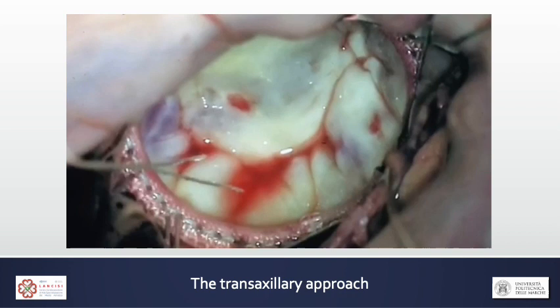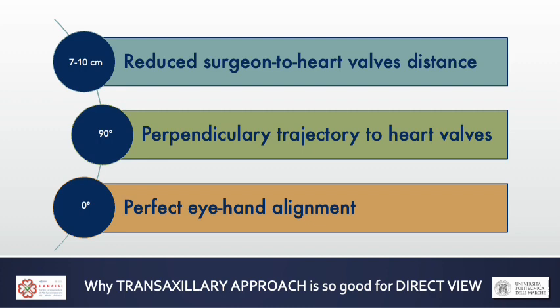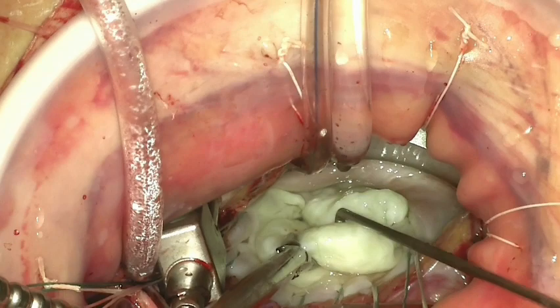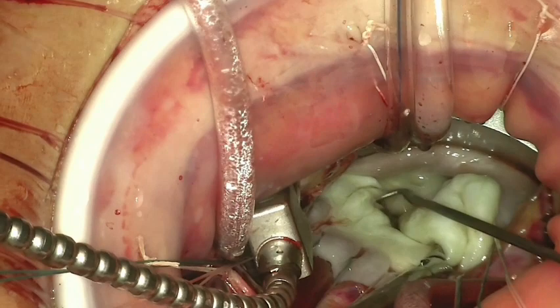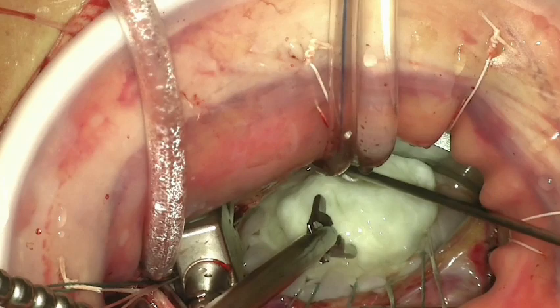Here you can see how we visualize the mitral valve. You see the almost invisible incision and the cosmetic benefits. These are the greatest advantages of this direct view approach. The mitral valve is only 7 to 10 cm away from the surgeon, clearly perpendicular to us, so it is easy to work on, thanks to a perfect alignment between our eyes and hands, with no need for endoscopes on the table.